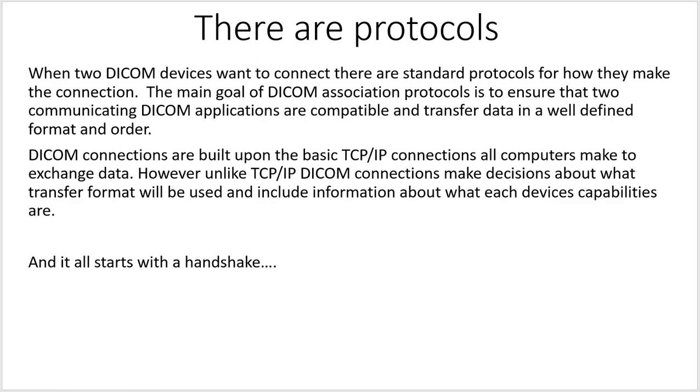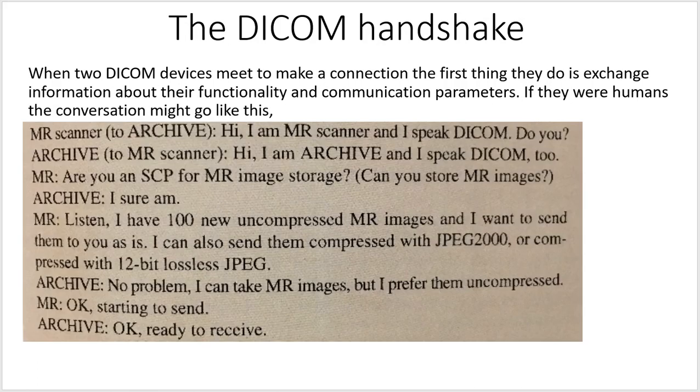Kind of like two people meeting for the first time, right? There's a protocol when you meet somebody in a business setting. You do a handshake. DICOM devices have a DICOM handshake. When two DICOM devices meet to make a connection, the first thing they do is exchange information about their functionality and communication parameters. If they were humans, the conversation might go something like this.